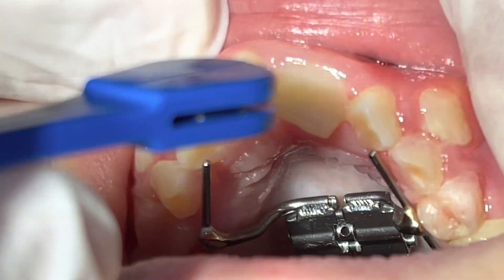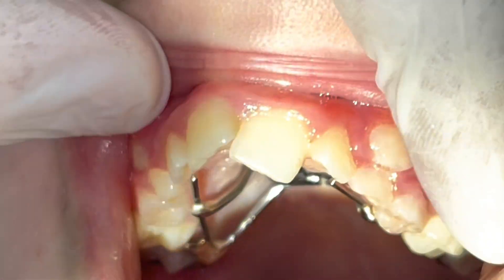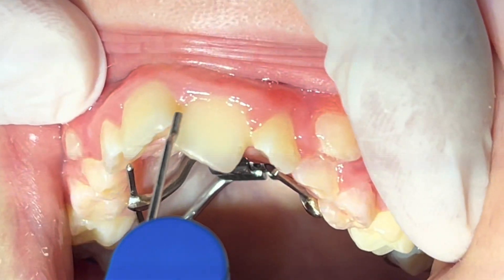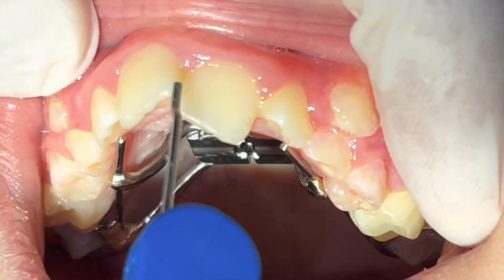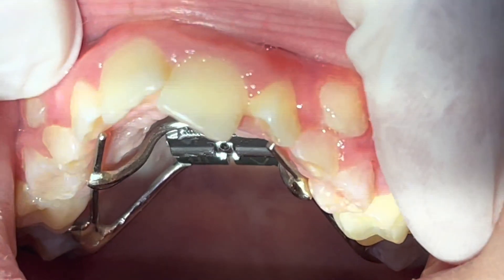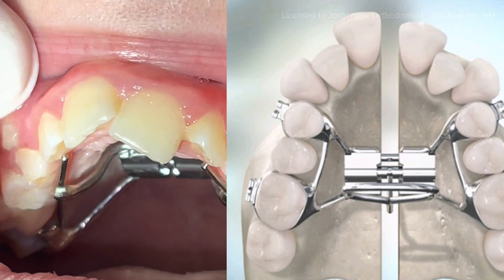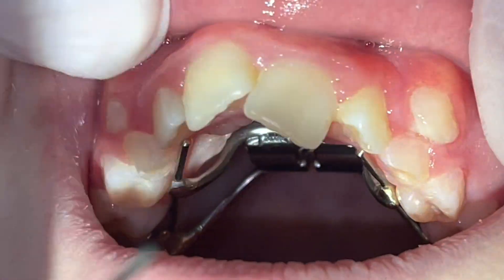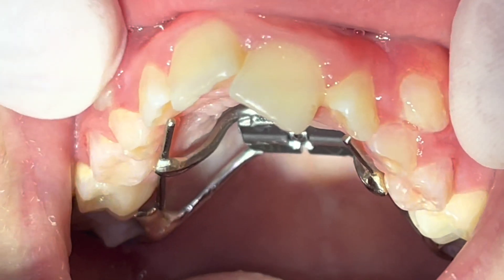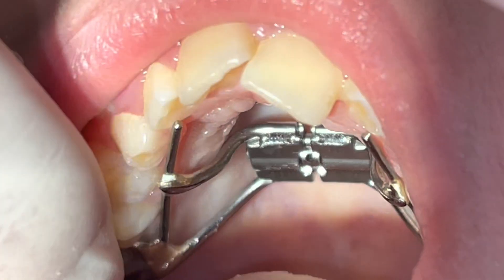After 10 days we should notice a gap in the middle, which means the splitting of the maxillary palatal suture. That expansion and splitting will lead to more nasal cavity volume, more space for the tongue and speech, and more space for the permanent teeth to erupt. This device should be avoided in children younger than seven years old to avoid any deformity in the nose.